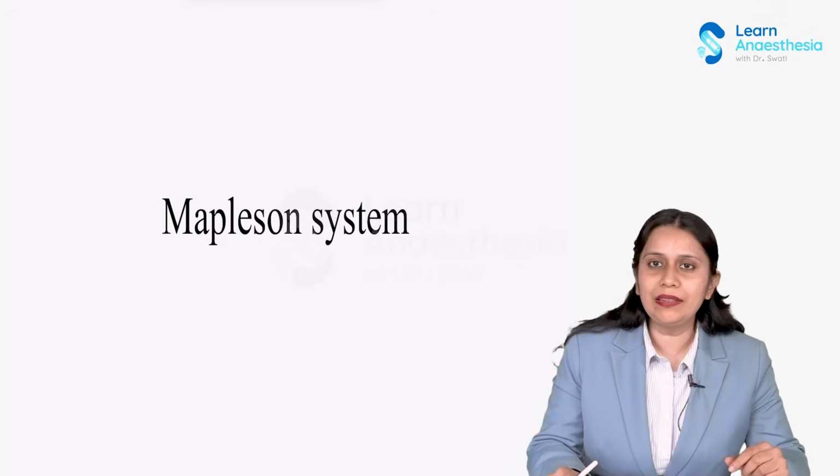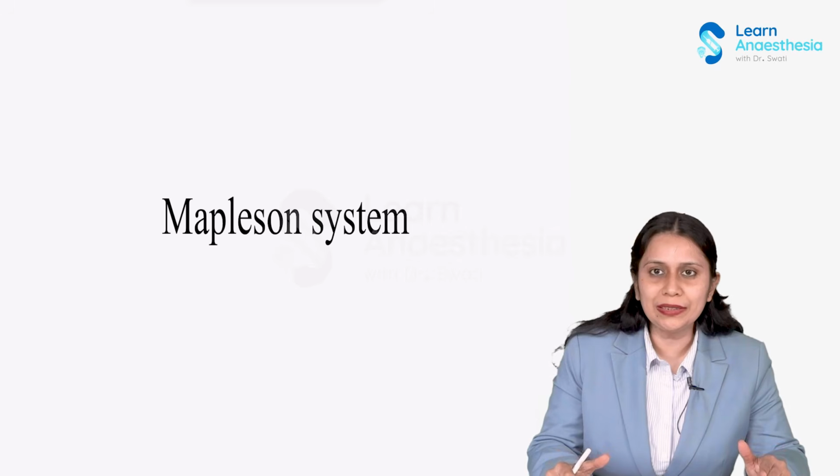Hello, in this section I will talk about Mapleson system. Mapleson system, which is a breathing system. So what do I mean by breathing system? Breathing system is a connection between anesthesia machine and patient.